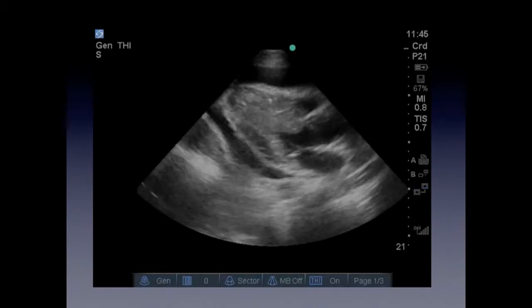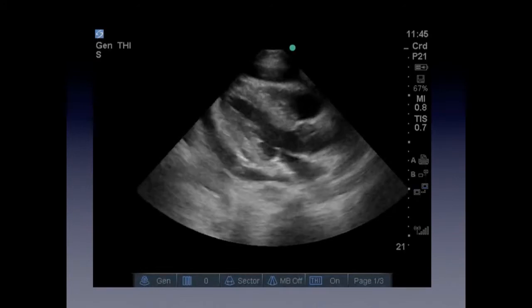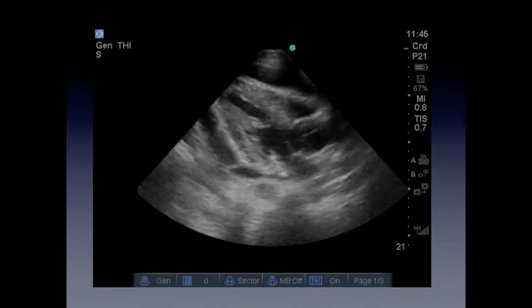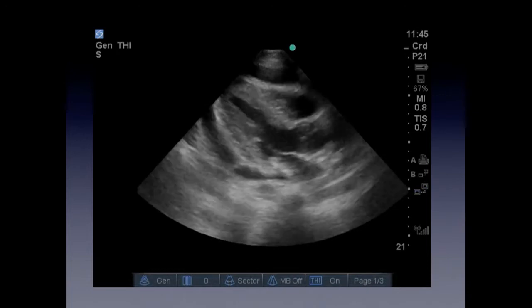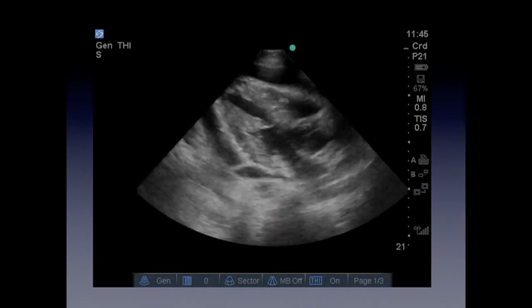This other patient, as you can obviously see, has the heart surrounded by fluid. You have the descending aorta there — a little bit harder to see — but you do see the free fluid.